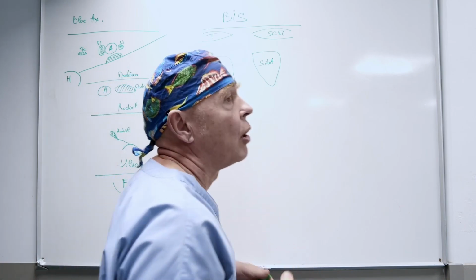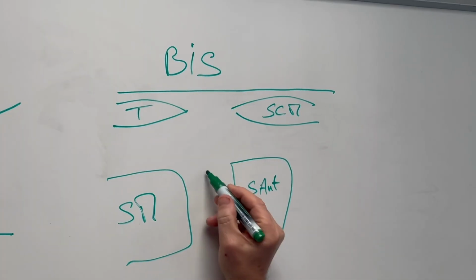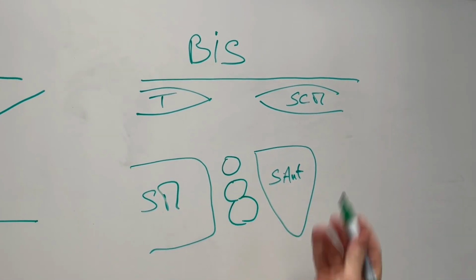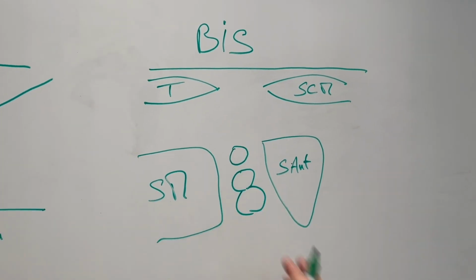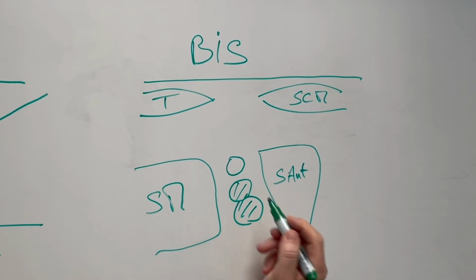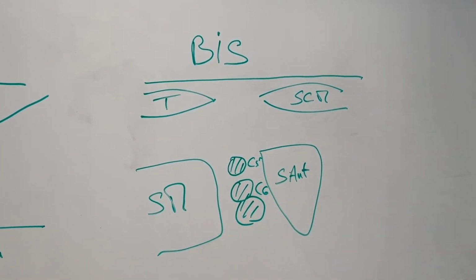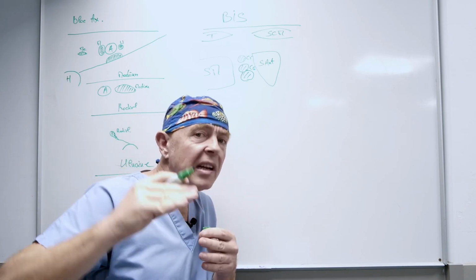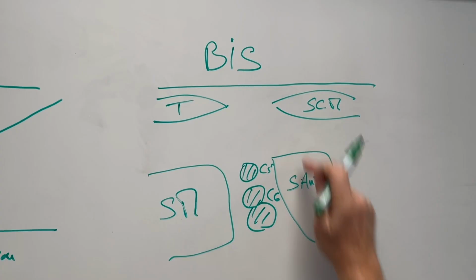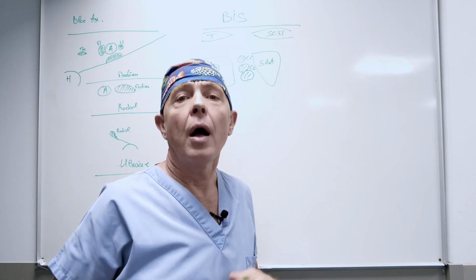Thus, the block in question is the interscalene block, and you will locate your brachial plexus along with your C5 nerve roots. And C6. Often C6 has a bilobed appearance, but you will see that later, when you unfold the plexus a little, it can also appear bilobed. So what is quite important is that even when you have this image, make sure to check a few centimeters by slightly moving your probe to verify that there isn't an anatomical variation and that C5 is not actually here and what you thought was C5 wasn't C6. Otherwise, you will have an incomplete block, okay?